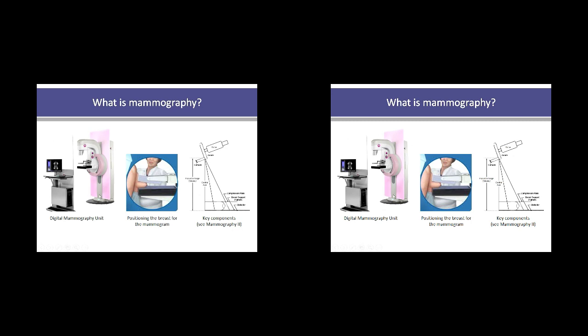Siemens have flashing lights at the back. It goes from pink to green to gold to try and calm the woman down as the radiographer applies about 20 kilograms of force to her breast. So it really is not a hugely pleasant exam to undergo.